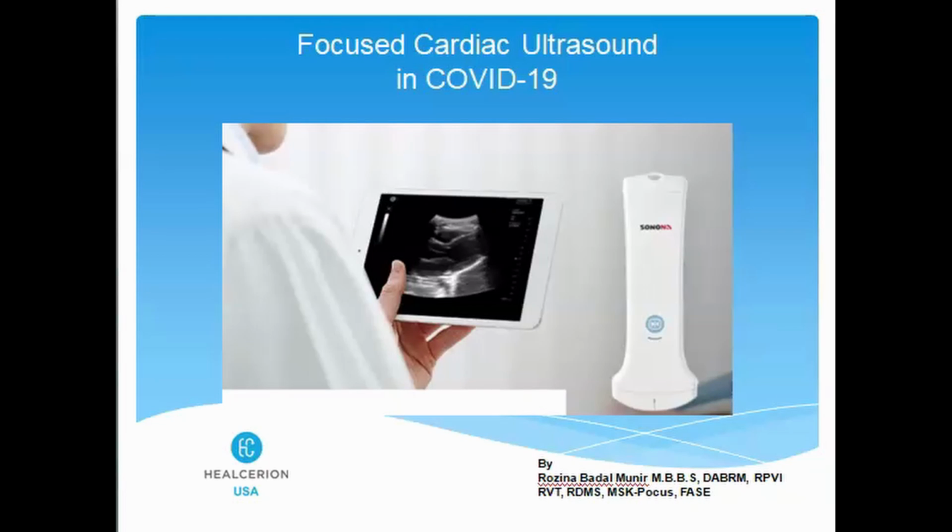Hi, I'm Rosina Badal Munir, and today we will learn about the focused cardiac ultrasound in COVID-19 patients.